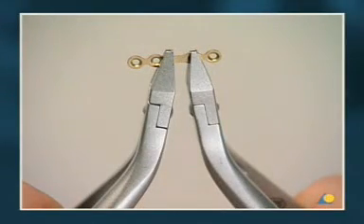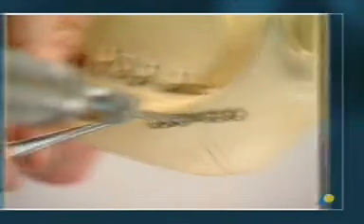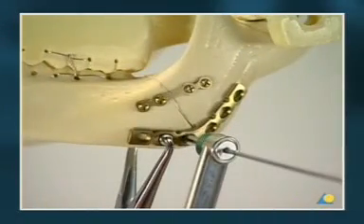Adaptation and fixation of a 4-hole 2.0 mandible mini plate at the upper border with 6 mm long 2 mm screws. Adaptation of an angled 2.4 universal fracture plate to the lower border of the mandible. And fixation using 2.4 mm screws in the neutral position.